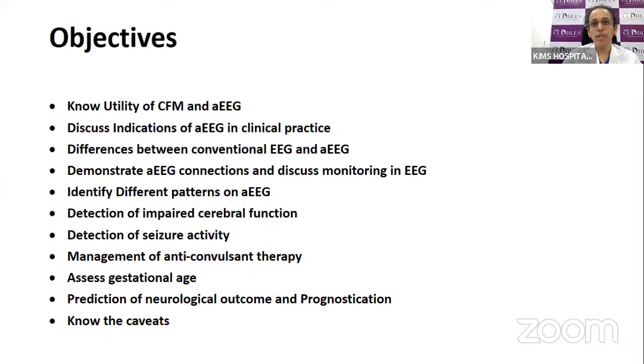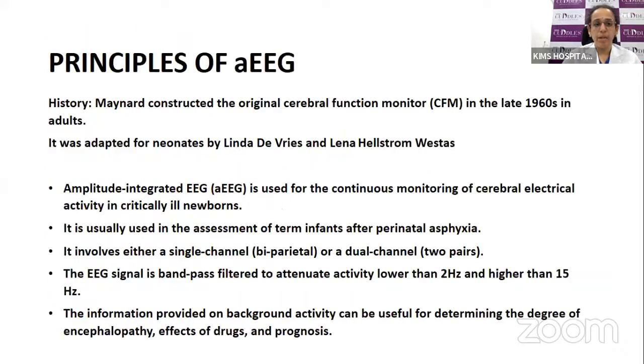So to identify the seizures at any particular point of time, continuous EEG is always beneficial when compared to the intermittent EEG. So that is the limitation of the EEG and the interpretation of the same. How to interpret whether this is related to artifact or whether it is related to seizure is one learning point that everyone should practice and keep on doing in the NICU so that the utility of the EEG in diagnosing the seizures can be maintained.